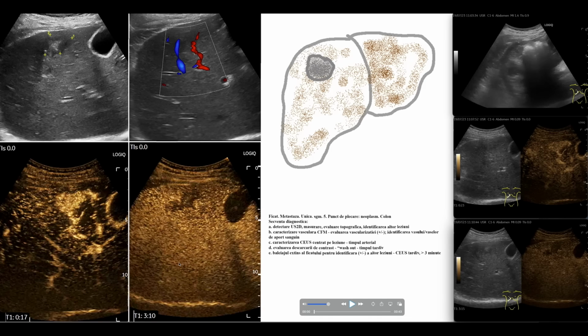We are therefore comparing arterial time and venous time. The tumor in arterial time is markedly loaded, and we see the inflow vessel. In the late time, it washes out. The supply vessel is no longer apparent. In arterial time, the liver is underloaded. During late, liver is fully loaded with contrast agent, which makes it easier to visualize the formation.